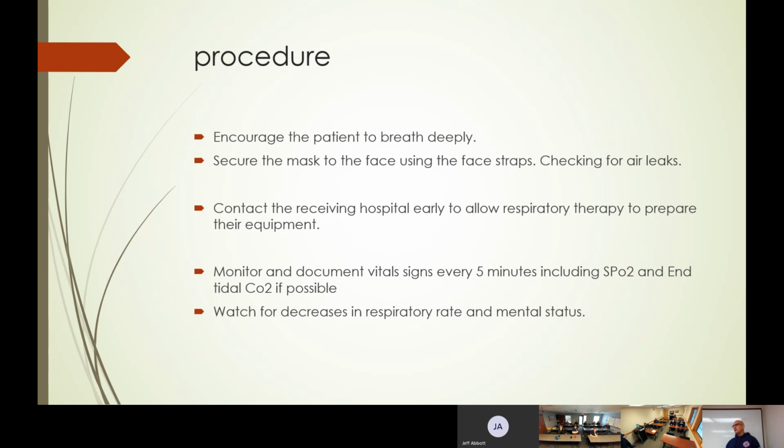When we're talking about vitals, we need to get vitals immediately during our assessment, right? The patient assessment and baseline vitals is probably the most important thing we can do right out of the gate. And what does that information, especially the SpO2 reading, do for us moving forward through the duration of the call? Trends. Yeah, it shows whether what I'm doing is helping or not, right? So don't forget the SpO2 reading when we're getting our vitals. Get all of your vitals, recheck them as often as possible, but this gives everybody an opportunity to see if it's giving them the positive impact that we had hoped, okay?